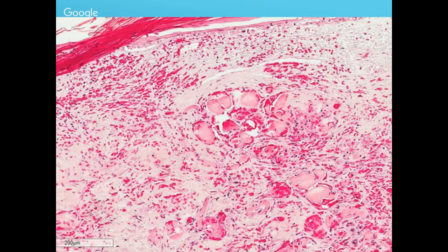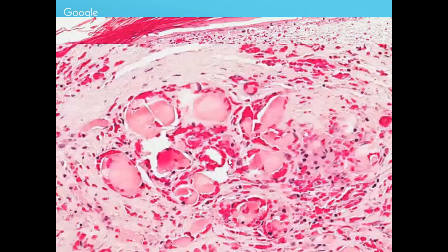So the important thing to recognize is this is a vasculopathic reaction pattern. That is the important thing that you need to recognize at this point when we're talking about reaction patterns. We could actually do an entire lecture on the vasculopathic reaction pattern, but the main crux of today is to help you recognize all the different reaction patterns. The prototypical thing that you're going to see here is thrombi in all the different vessels of the dermis, and you can highlight this with a PAS stain. So you can do a PAS to highlight the thrombotic material, and if you see that, then this is a vasculopathic reaction pattern.